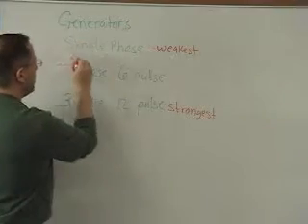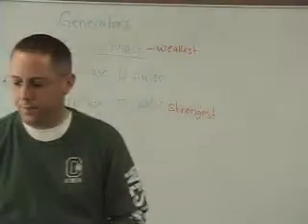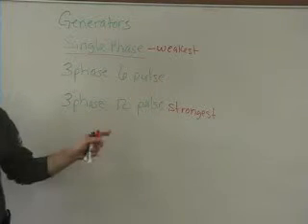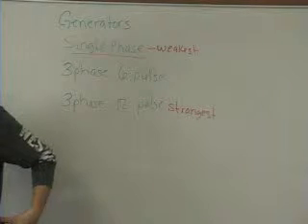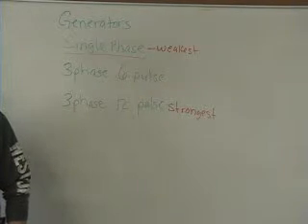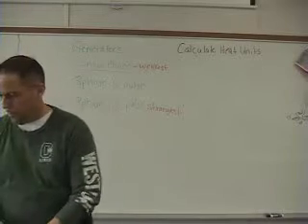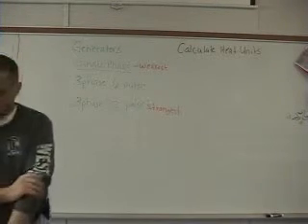This is pretty much what most doctors' offices have, a single-phase generator. And this will be important in a minute because we have a new type of math problem to do based on what type of generator you have. You're going to calculate what's called the heat units. On page 79, if you skip ahead to that, it shows you an example.